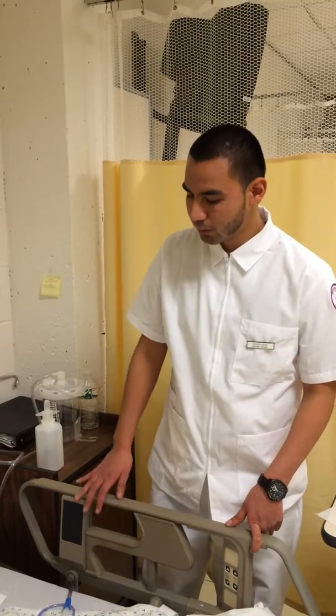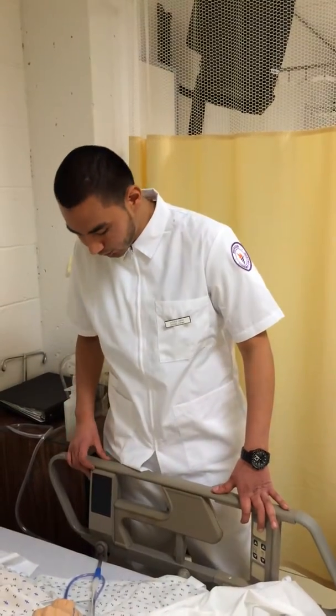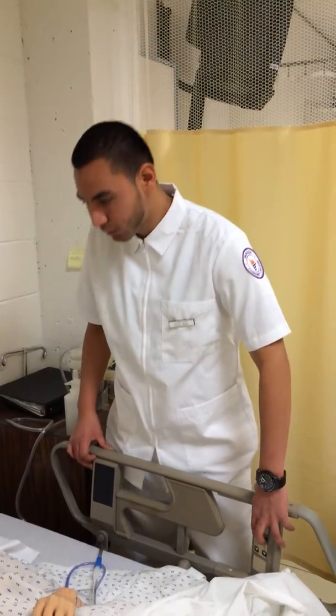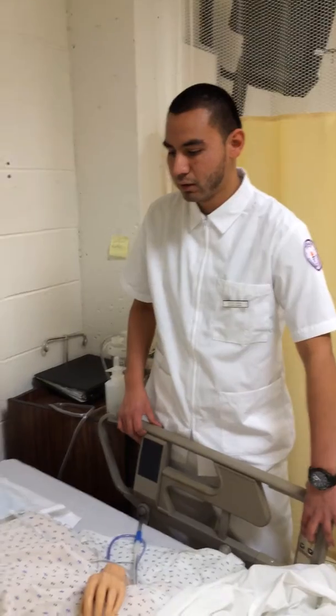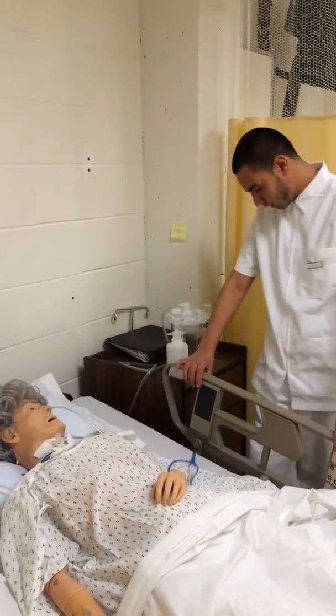You want to have the patient in supine position, head at 30 degrees, and you want the bed up at your working height.